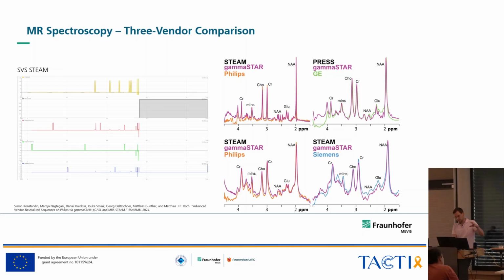If you see that, you think, okay, we have this great spectrum and we see all these peaks, but in reality, there would be a water peak up to the roof. So we need to get rid of that. So we need a very precise water saturation, which means that all these MR sequences really need to be played out exactly as they were implemented.